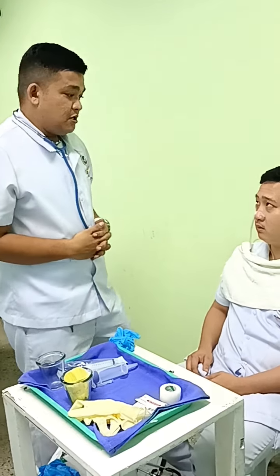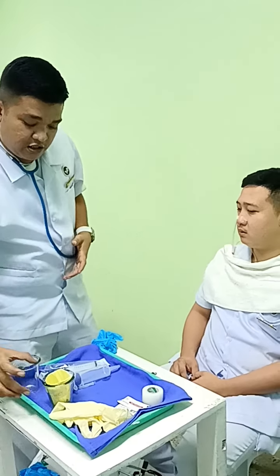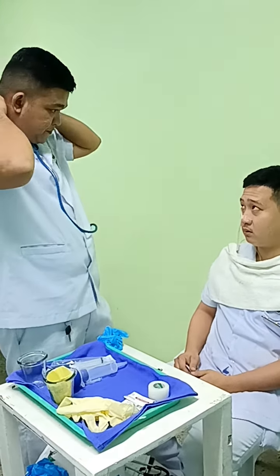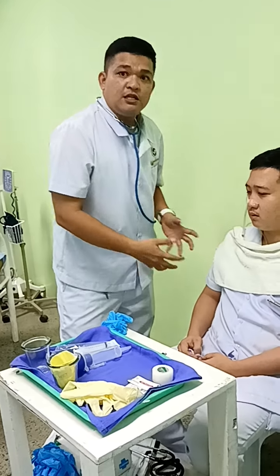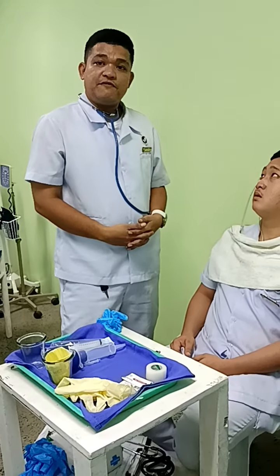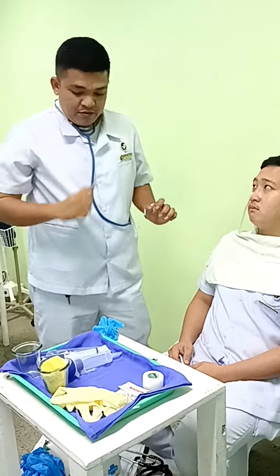So sir, I will be feeding you for today. Maintain a high Fowler's position, just the same as usual, for 30 minutes to 1 hour to promote digestion. So next is to prepare the equipment, remove gloves, and perform hand washing, and then we also have to dispose all the materials used.